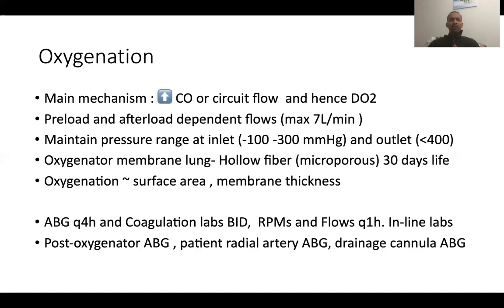And usually we get ABGs Q4 hours, and coagulation labs twice a day because of the hemolysis that happens, and also because of the heparin that's being used for the circuit. And we check the rotations per minute and the flows every 1 hour to chart. And these are perfusionists that are doing these jobs, and sometimes in other places, the respiratory therapists or the fellows.